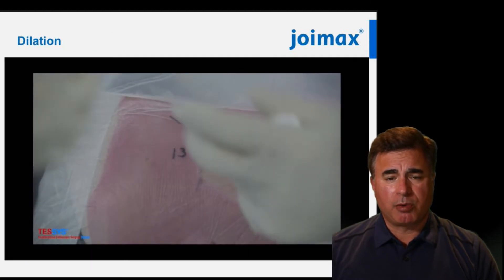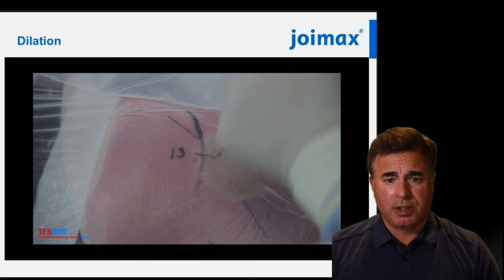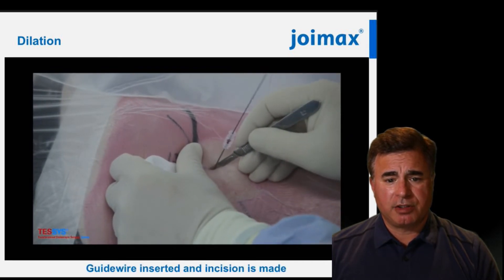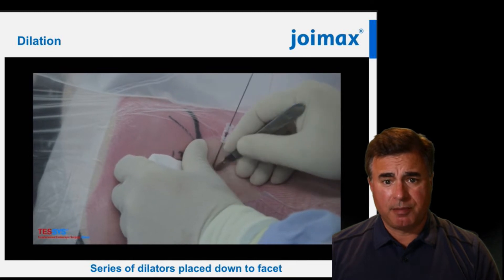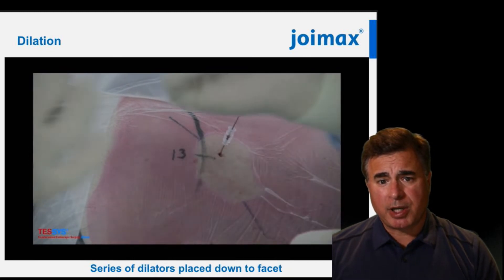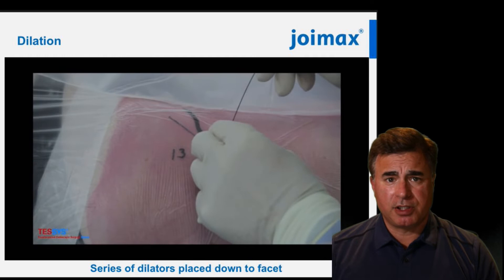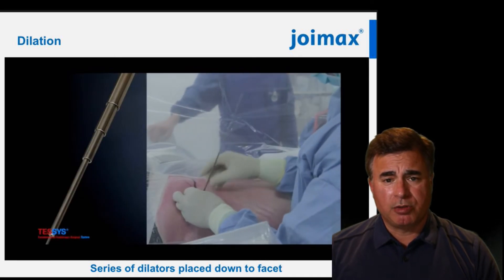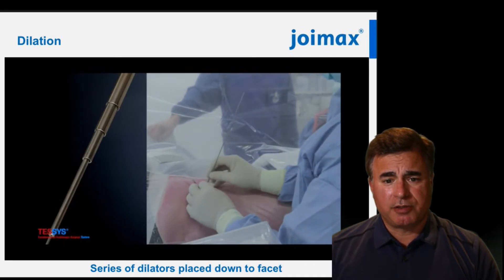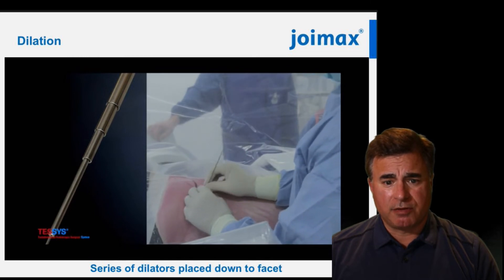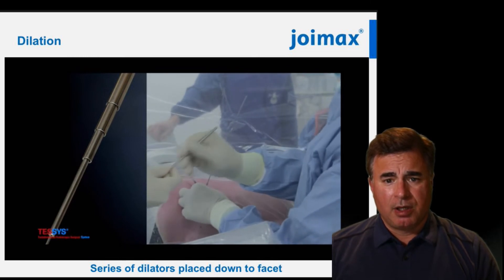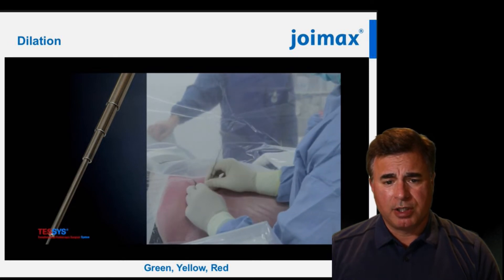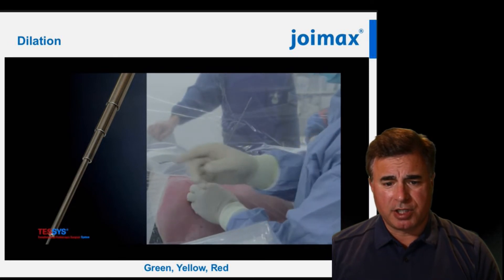In this short video a guide wire is inserted through the needle. An incision is made and then a series of serial dilators is placed down to the facet. The goal here is not to enter the spinal canal but rather to dilate off the soft tissues for the crown reamers — we don't want the crown reamers to injure the soft tissue before they get down to the facet joint. The guide wires as well as the reamers are color-coded green, yellow, and red, indicating progressively larger sizes.